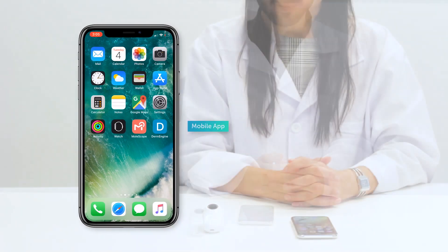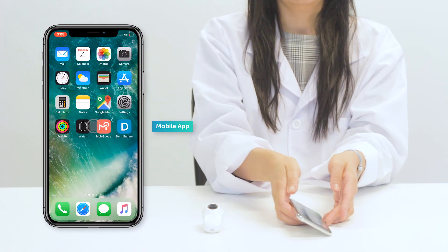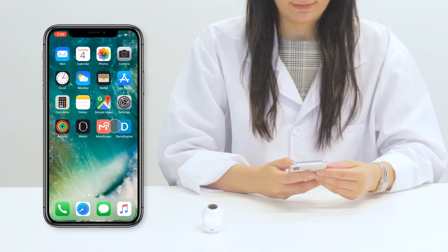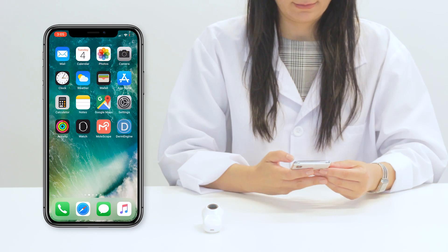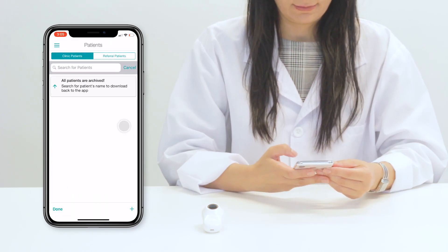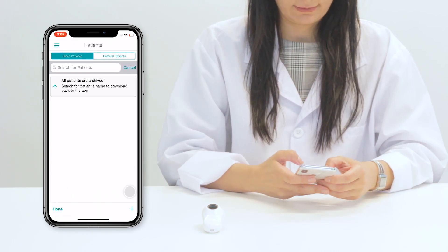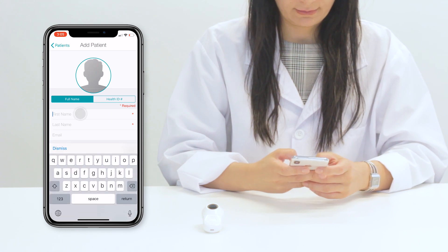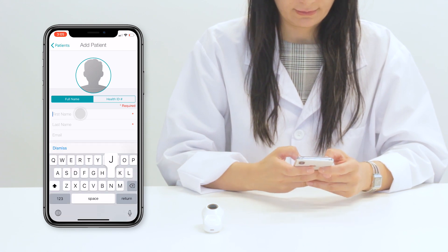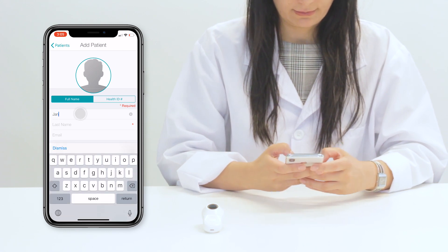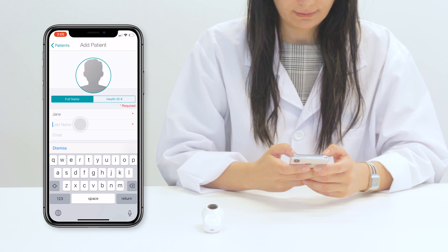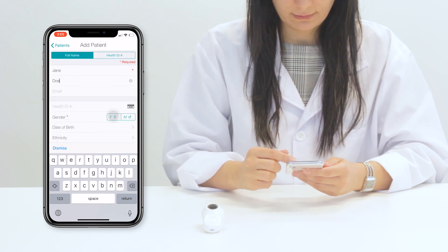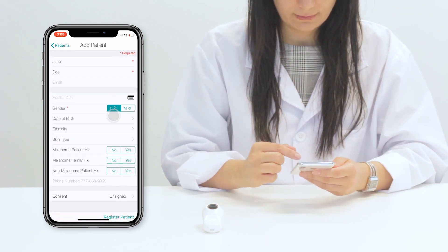Let me walk you through the mobile app and a clinical workflow for your practice. First, let's create your patient. From your patient's list, press the add button to add your patient. A form will appear for you to simply fill in the patient's information. Once you're done, press Register Patient.